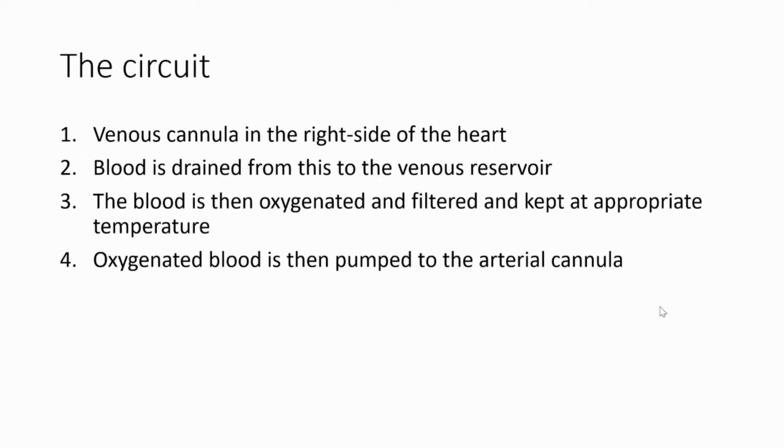So step 3, to be honest, if you want to be a surgeon, you don't need to know everything that goes on in terms of the physics of it and everything within the machine. You just need to know the principles of what the machine is doing. It's oxygenating, filtering, and managing the temperature, and then pumping at a sufficient pressure through to the arterial cannula, which is placed in the aortic root. So that then allows blood to be perfused to the rest of the body, and you can see then how you bypass the lungs and the heart.